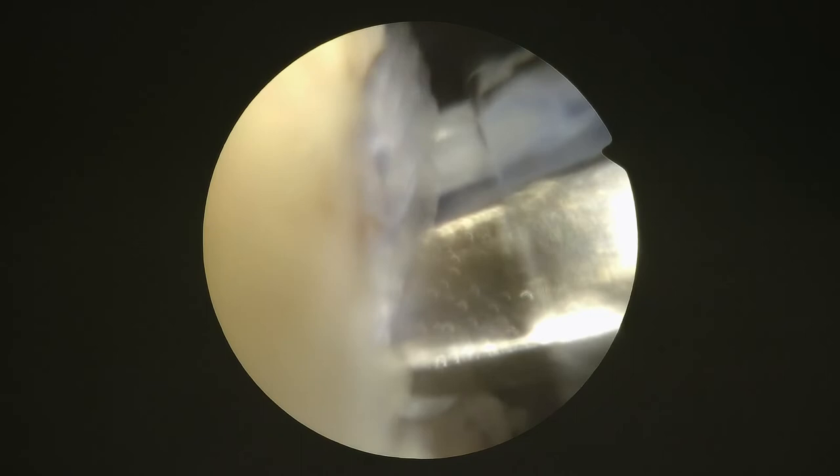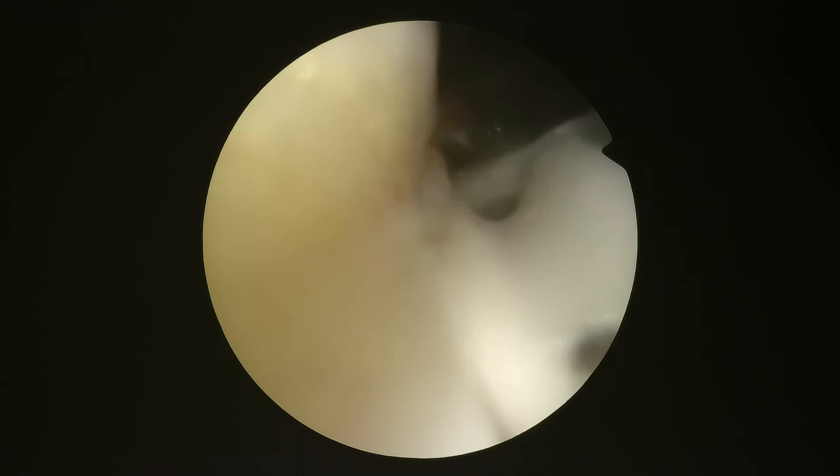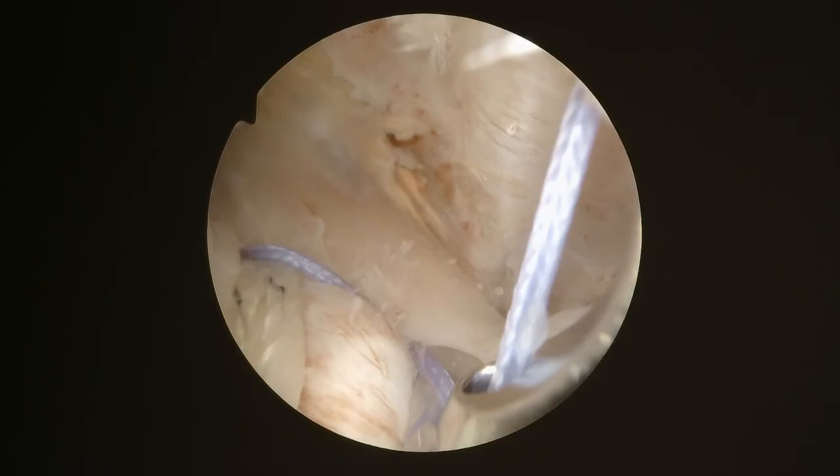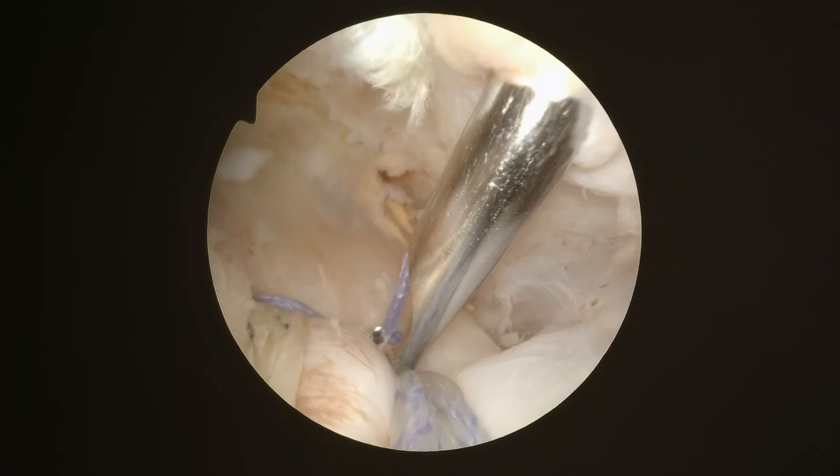We've got good compression of the cuff to the bone. There are multiple different ways to fix rotator cuffs — this is just one of the common ways that we do it. This is another anchor going in, and this is the rotator cuff after the sutures are on top. We link the two medial sutures together to get a little more compression, cut the edges, and here's our final repair with the rotator cuff attached to the bone.